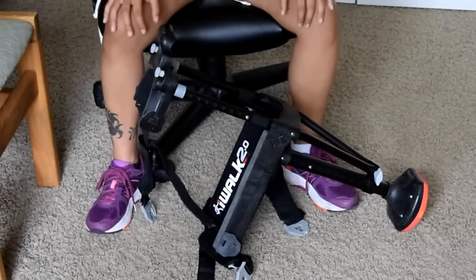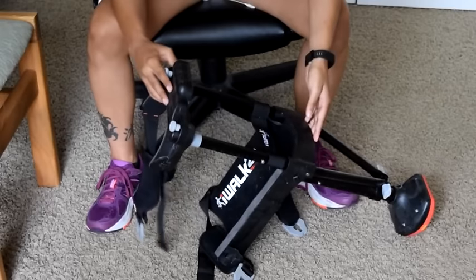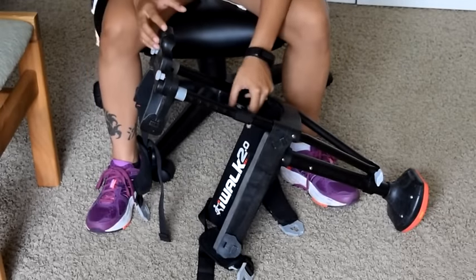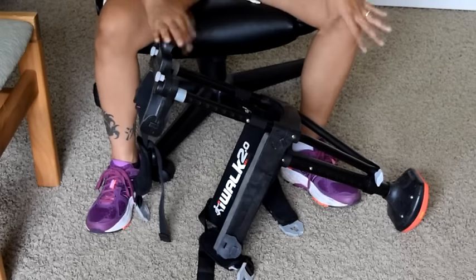Hey everybody, so this review is going to be on an iWalk. You can actually get these from their website, from Target, and I've seen it on Amazon. It's 150 bucks.